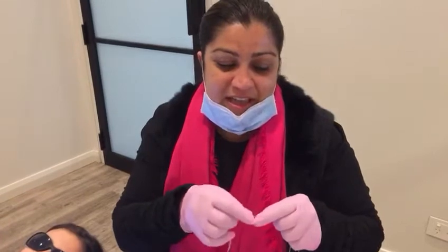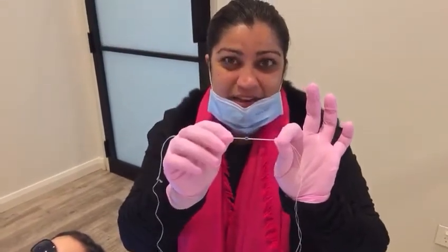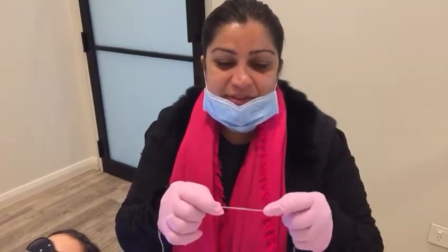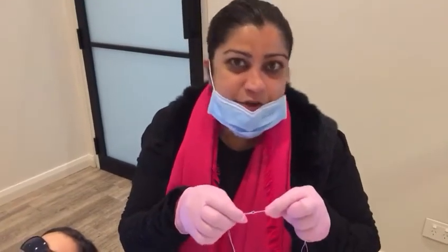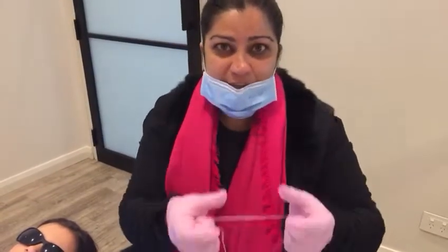She's coming this morning to actually get something called separators put in between her upper 16 and 26. She doesn't have sevens erupted yet, so we're going to put it on the mesial contact. You have to have spaces at least a few days before to allow the expander to sit.